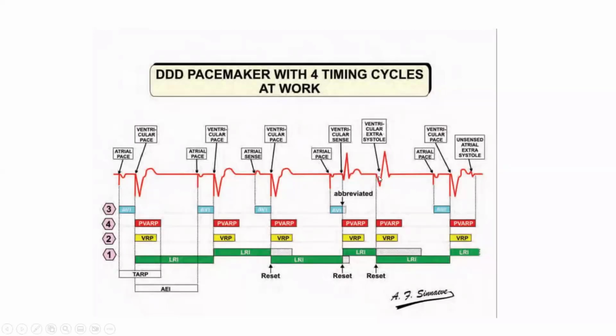It's a ventricular event following a ventricular event without an atrial event between. So for the pacemakers, this is a strange event and it marks a PVC. The PVC, like any other ventricular event, will initiate VA interval, ventricular refractory period, and lower rate interval. And if this atrial escape interval ends without a P wave, it will fire in the atrium, causing an atrial spike, P wave, AV delay, and then pacing of the ventricle with a QRS complex.